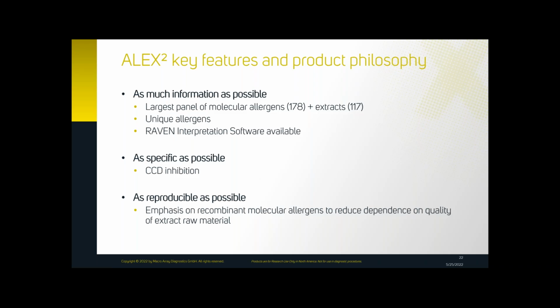That's why we use a CCD inhibition during the serum incubation. And we also try to be as reproducible as possible. That's why we emphasize recombinant molecular allergens to reduce the dependence on the quality of extract raw material.